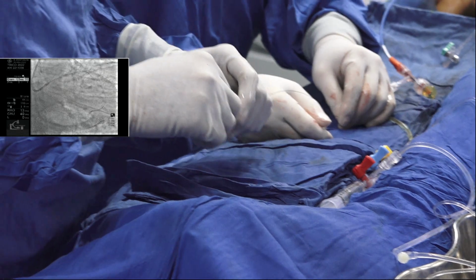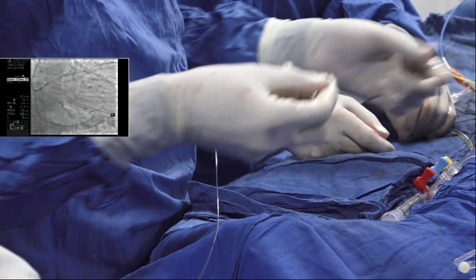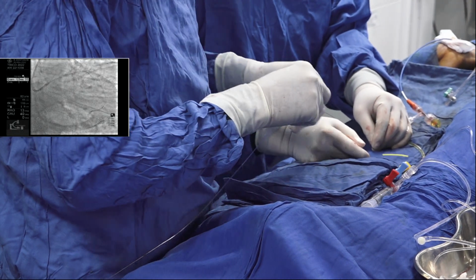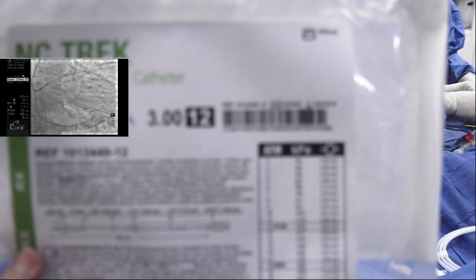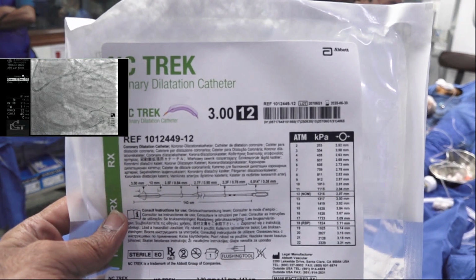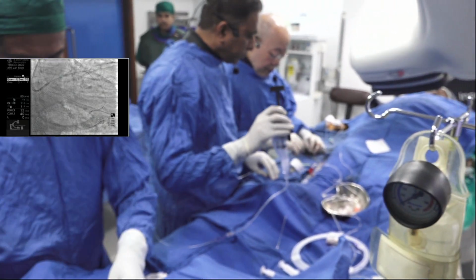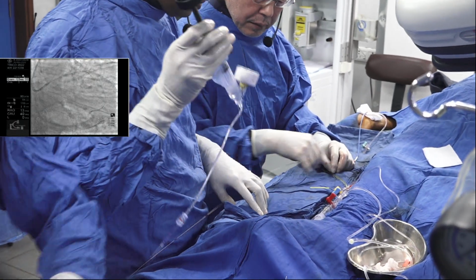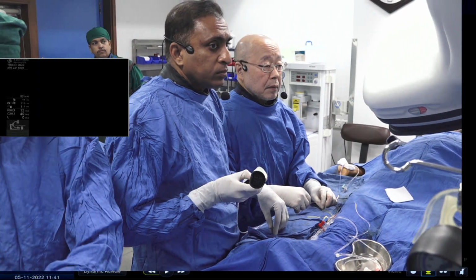So I think the question was routine kissing. I think Dr. Saito said earlier that that's his routine. But what about you guys at the panel? Maybe you can share your experience. If it looks perfect by angiogram, will you always do a kiss, never do a kiss, sometimes do a kiss? I think since we have treated the circ and we want to maintain wide access, I would kiss even at low pressure. I don't want to dissect the circ ostium. That's my main goal.